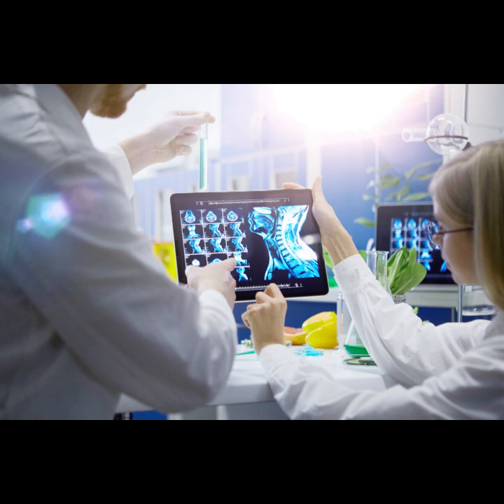We explored different mapping strategies, Cartesian, radial, spiral, each with pros and cons related to speed, resolution, and artifacts, all fundamentally constrained by that relentless T2 signal decay. And the core insight really is that MRI acquisition is this incredibly sophisticated dance against time, trying to paint a detailed picture of this rapidly fading frequency landscape, K-space, using gradient fields as our brushstrokes.